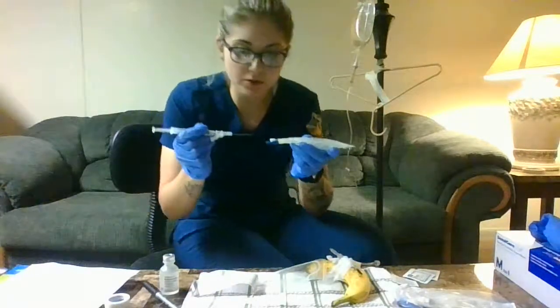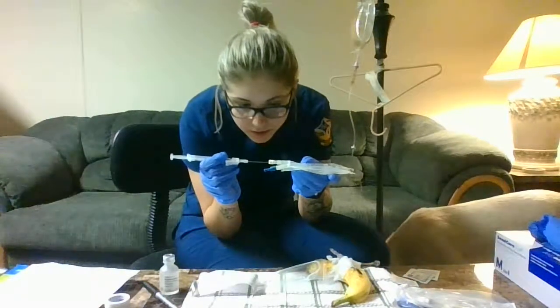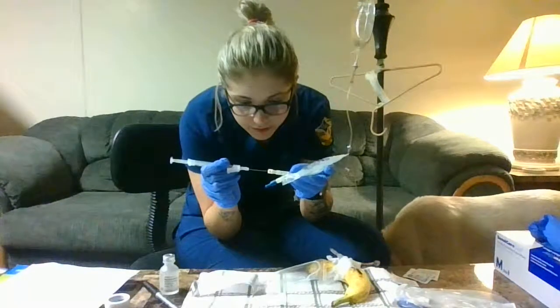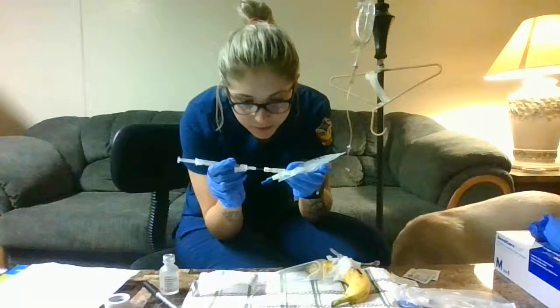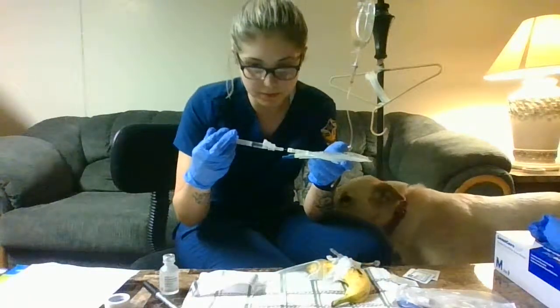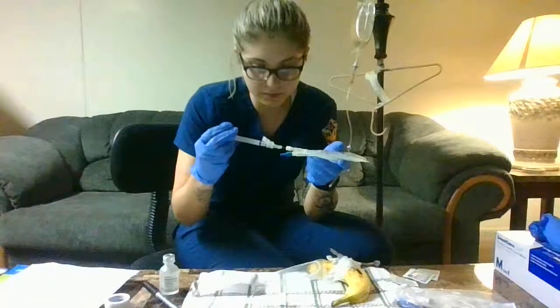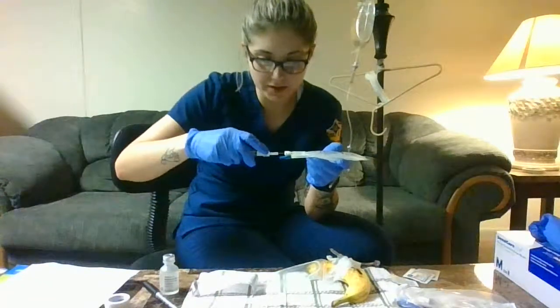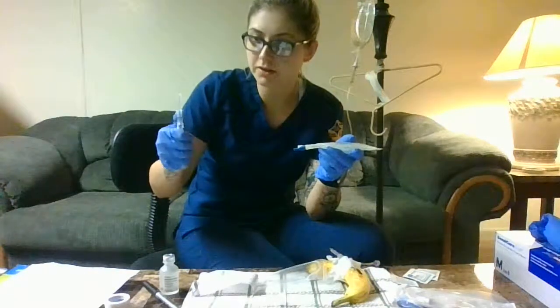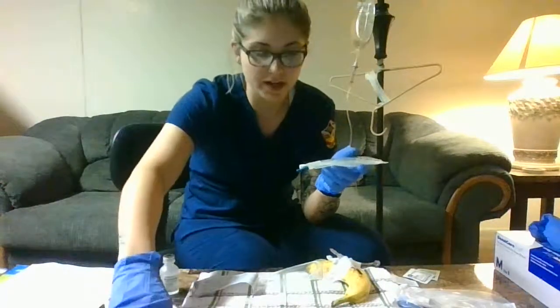You want to make sure that doesn't go through the ends or anything. So we're going to insert that through. Okay. Now we're going to put this in. Okay. Gonna take that out. Put your safety thing there and put this in the sharps container.